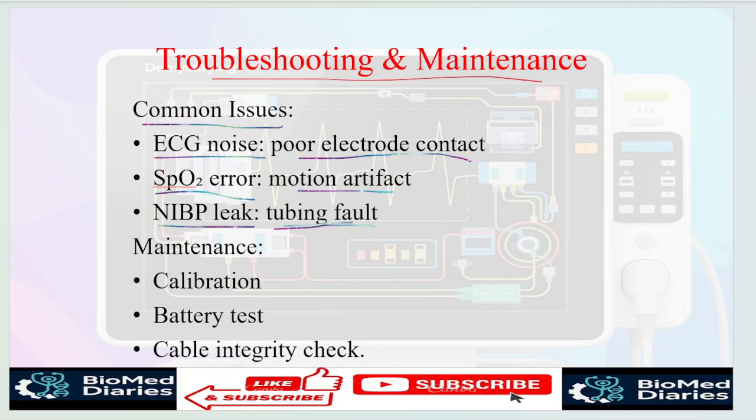So what maintenance should be done? Calibration should be done, a battery test should be done, as well as a cable integrity test, which will help so that ECG noise does not come frequently in the patient monitor.